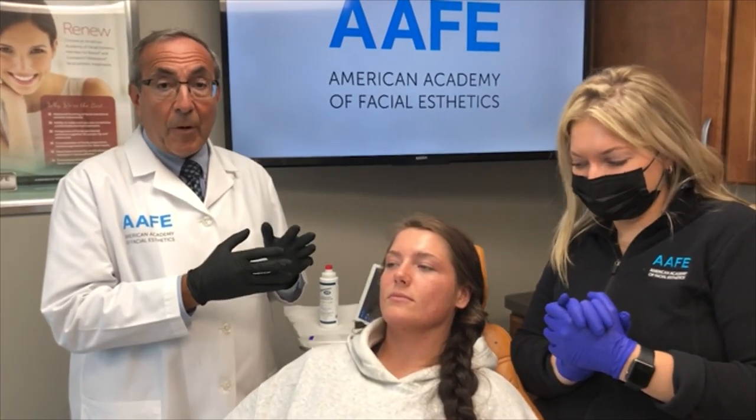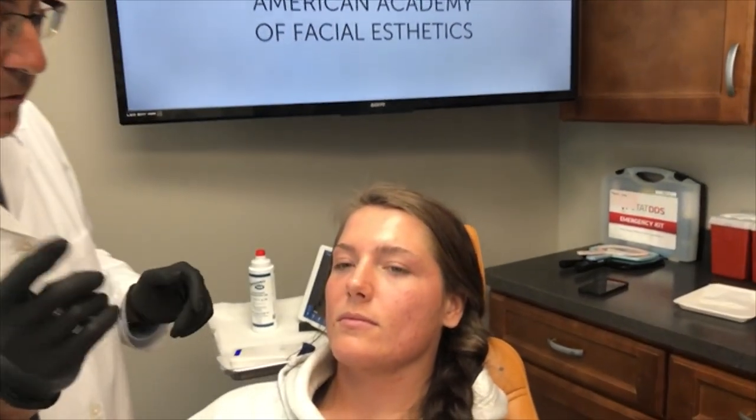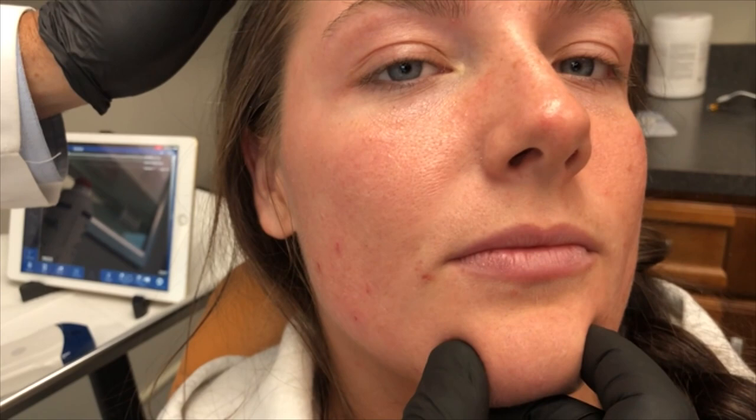We are going to do a demonstration using the WAVE-FE ultrasound on Mary-Kate here, and we want to show you what we're going to do with the treatment. But first, we're going to do some anatomy mapping on her. Come on in and take a look at Mary-Kate here, just look straight on at her, and let's talk about her treatment.